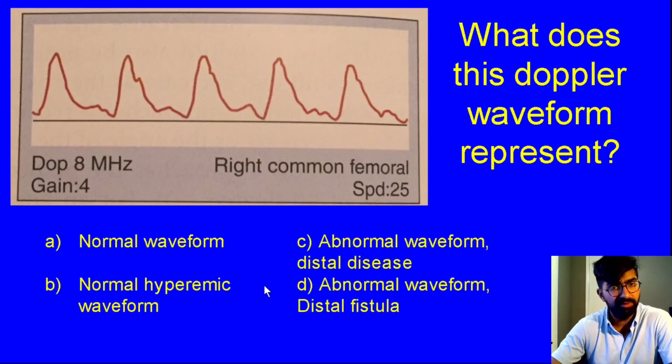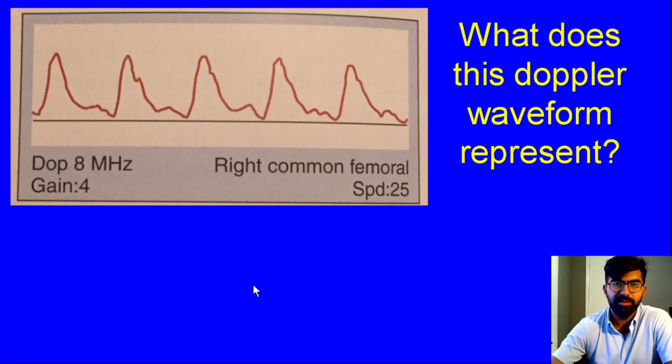Is it a normal waveform? Is it a normal hyperemic waveform? Is it an abnormal waveform which represents some distal disease? Or an abnormal waveform and has a distal fistula? So take a second to think about it.